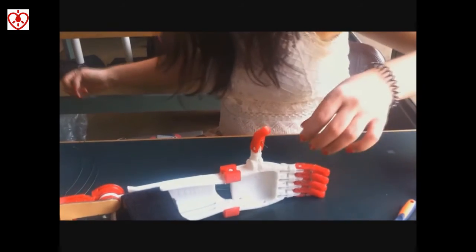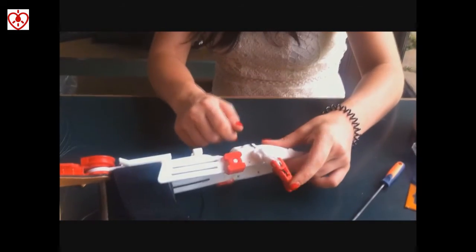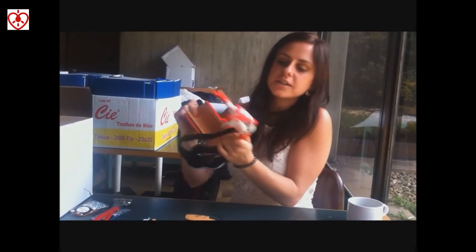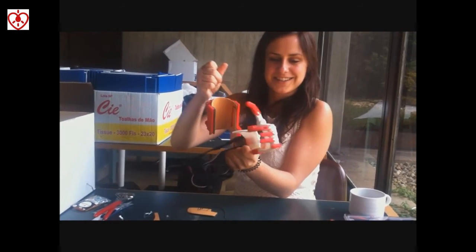It's moving here — so we have a finger. It does twist, so we have to tie it down. It's working already.